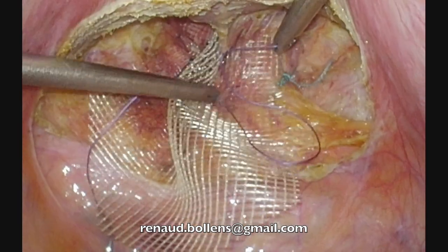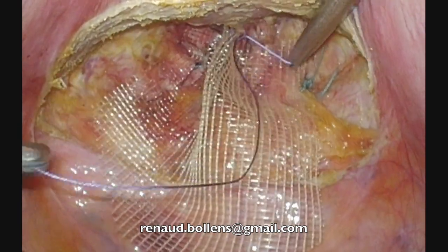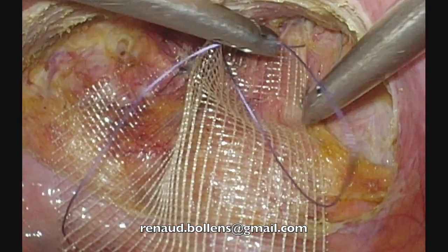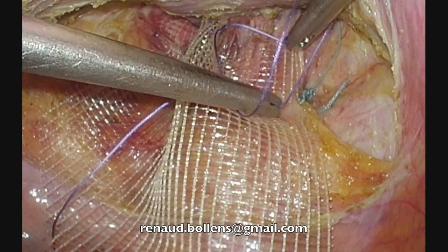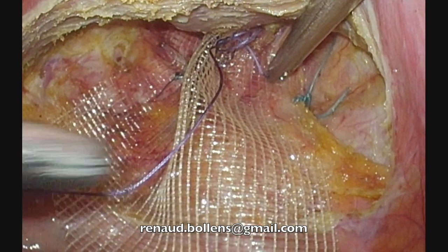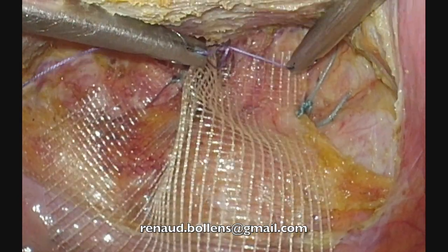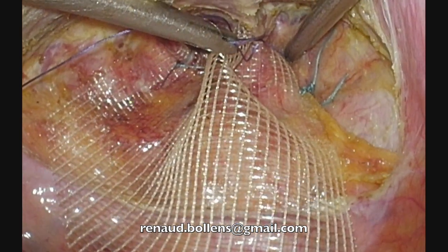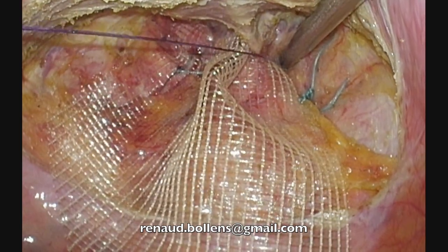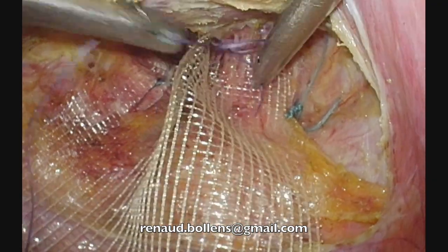Okay, I show you a technique if you have tension on the suture and the knot doesn't want to stay closed. I have done a first one, that's what I do. I do the second one. I jump over, I pre-close, but I don't tighten completely. I catch my loop. I re-close my first one. I maintain tension on the short thread to keep the knot tight. And then I take the long one and I close the second one on the first one. Okay, this is another basic technique, or a little bit more advanced.